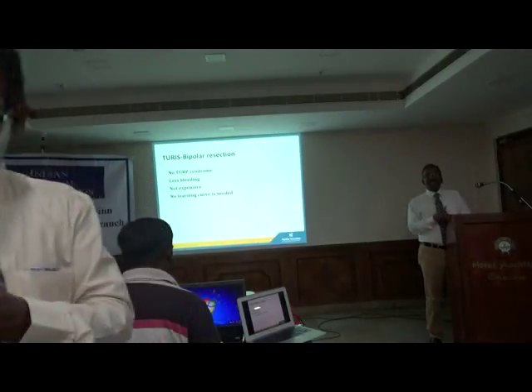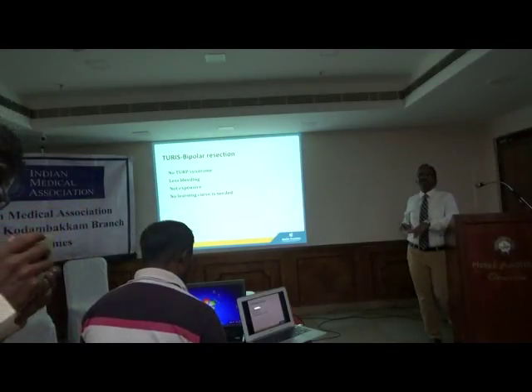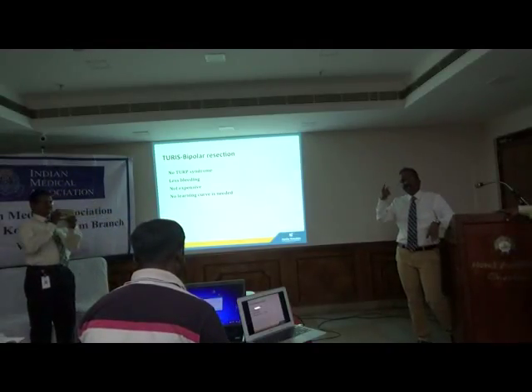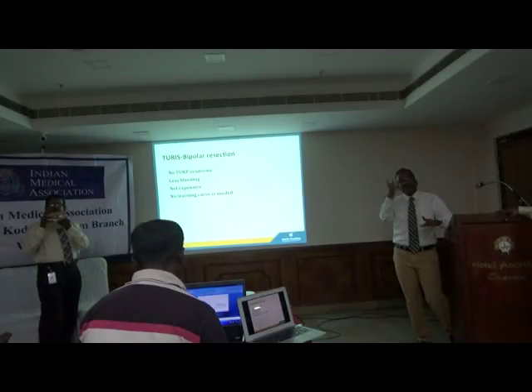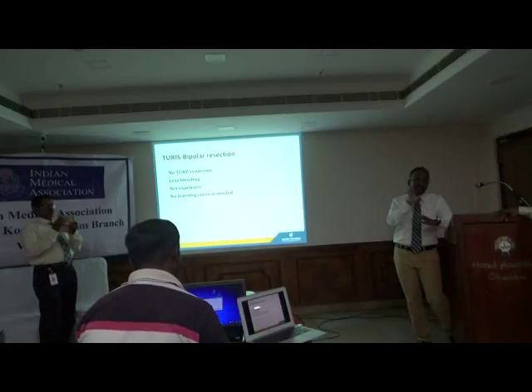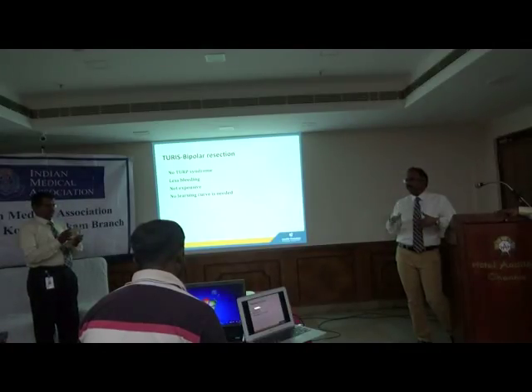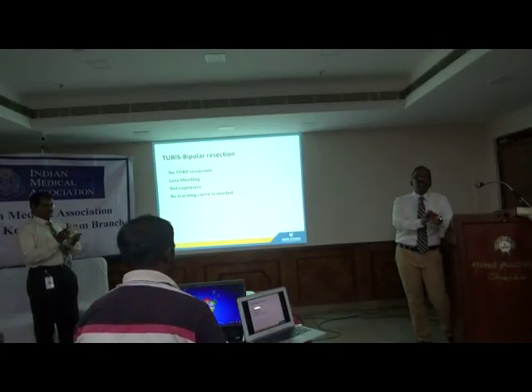Abdomen? Yes. What is the cost of the machine? Average cost? I think it's 10, and then annual maintenance is about 1, and then the instrument is a killer there. So now we have Xi, the latest one. What they do is once you move on to the next, the earlier instrument you can't use. So basically you have to buy a newer one. So that is why they're making a killer of this one. Each instrument can be used only 10 times, and there's a cost in US dollar value. Just switch on the robo with the minimal instrument, it comes to about 1.5 to 1.6.